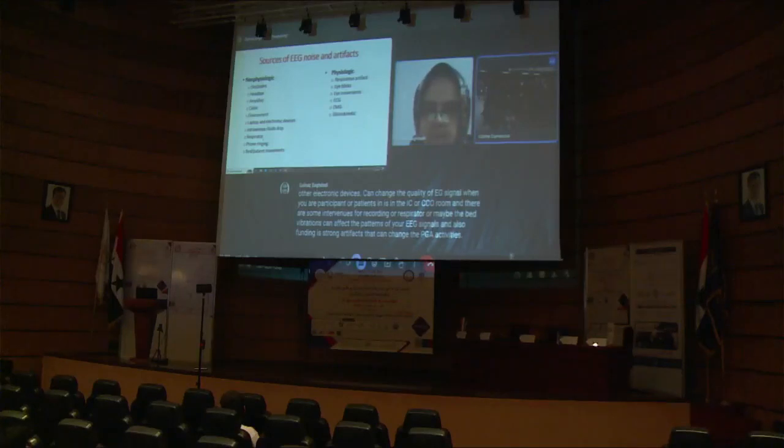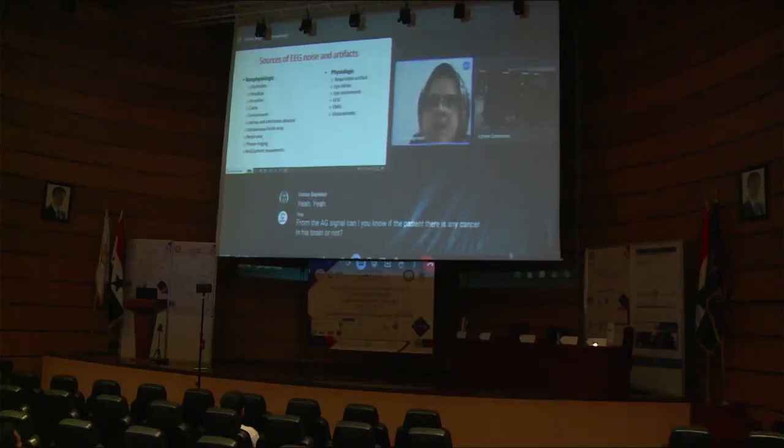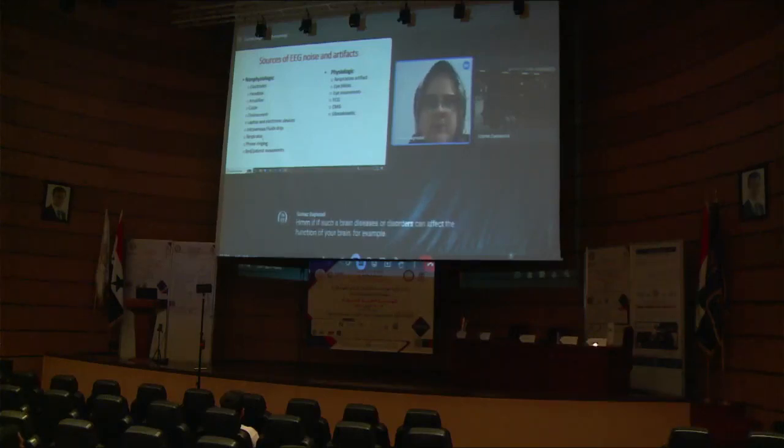Dr. Galnaz, can you ask? Yeah. From the EEG signal, can I know if the patient has any cancer in his brain or not? If such brain diseases or disorders affect the function of your brain, for example, maybe that cancer can change the asymmetry of your brain activity from the left hemisphere to the right hemisphere. It can be detected by comparing the left hemisphere activities with the right one.